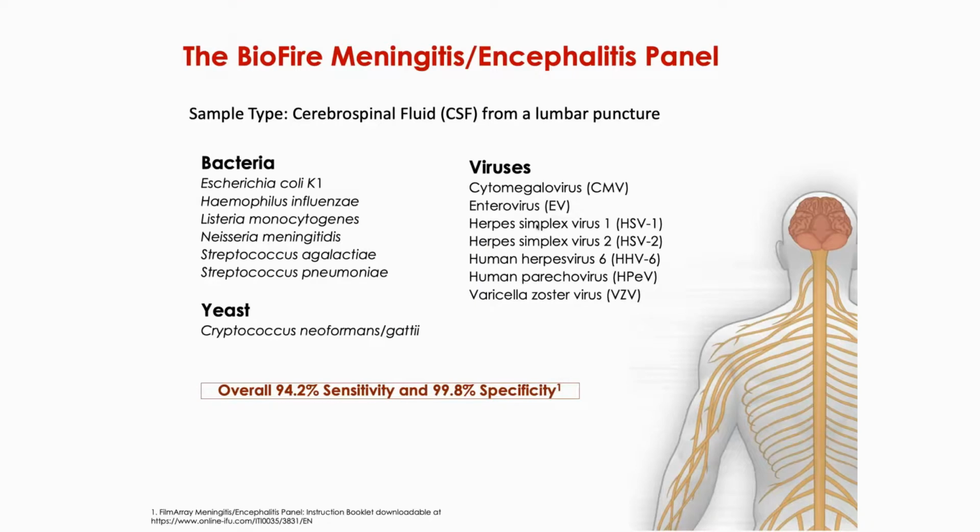As you all are very familiar with, here is the meningitis encephalitis panel. As you can see, all the bacteria, viruses, and yeast that are available on this. So imagine, here we are telling the emergency room physicians, listen, you do the LP, send the specimen downstairs to the lab, and in a short period of time, we're going to be able to tell you whether these pathogens are found in the specimen, right? Again, we have the list of bacteria, the viruses, and the yeast.